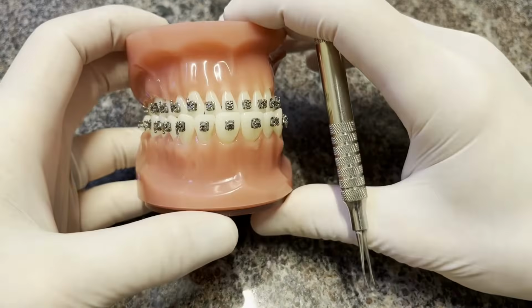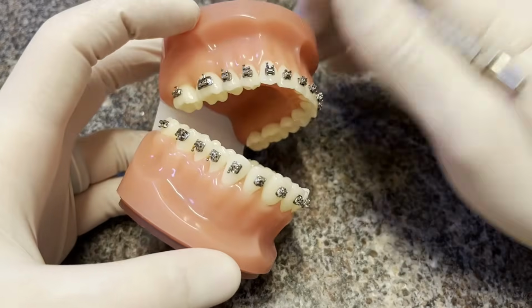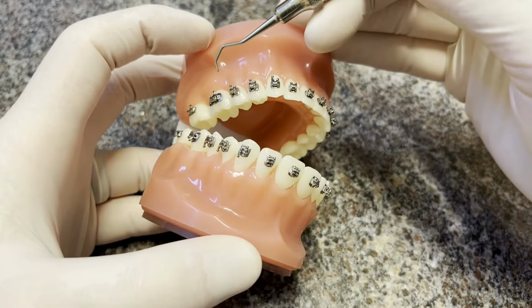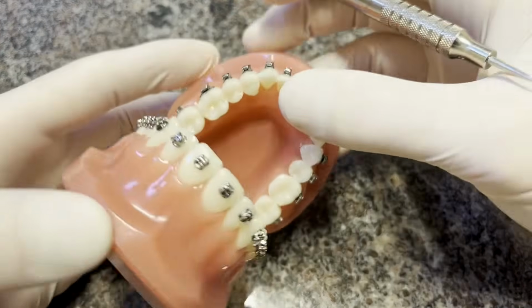So generally the patient will be upside down like this in the chair, so that's how we're going to look at these while we're placing them. Usually the doctor will place the 7 and the 6, and then usually the 5 and the 4. So we'll go over quickly how to place those.